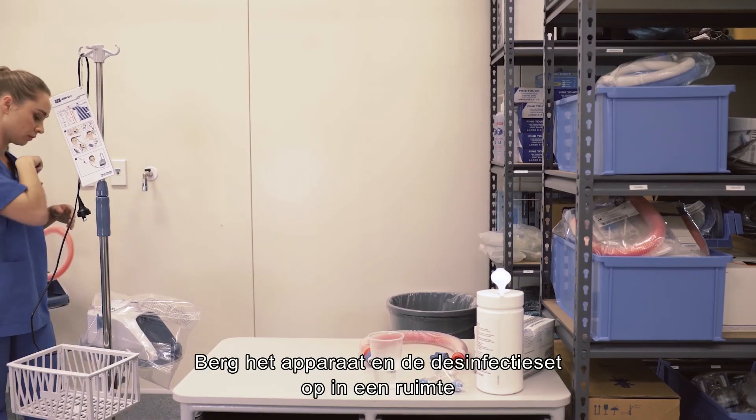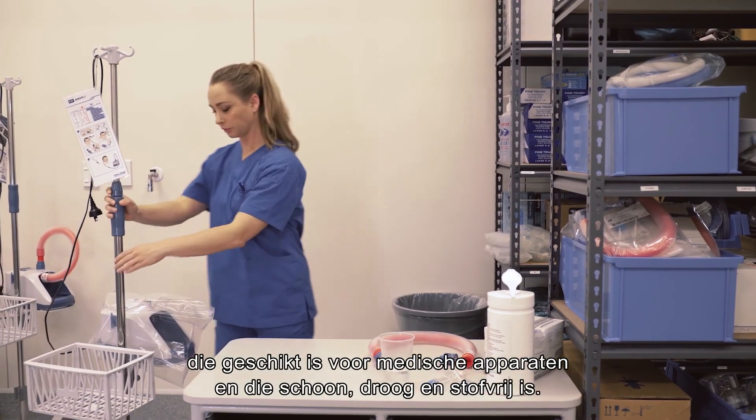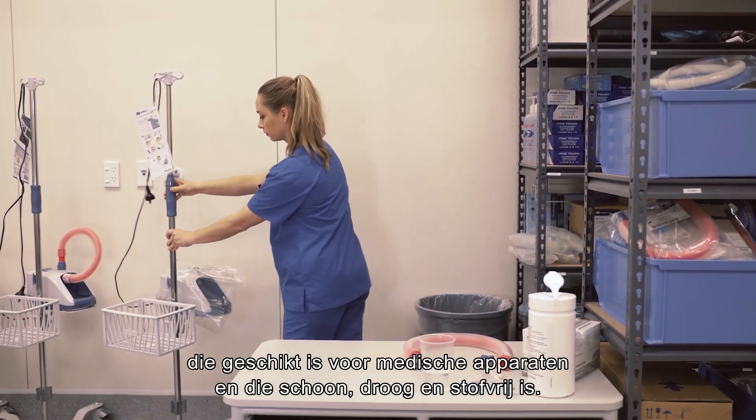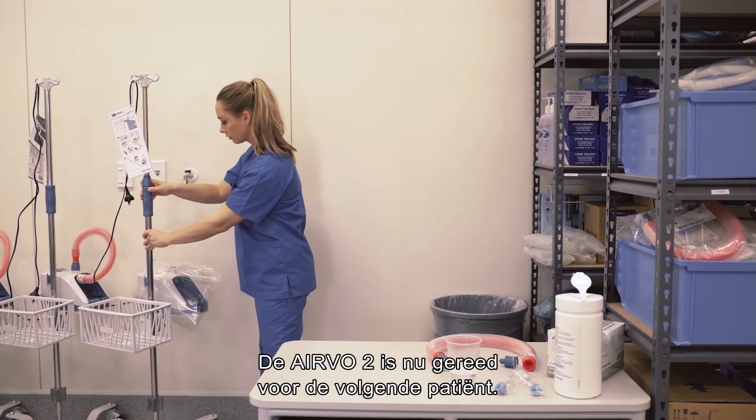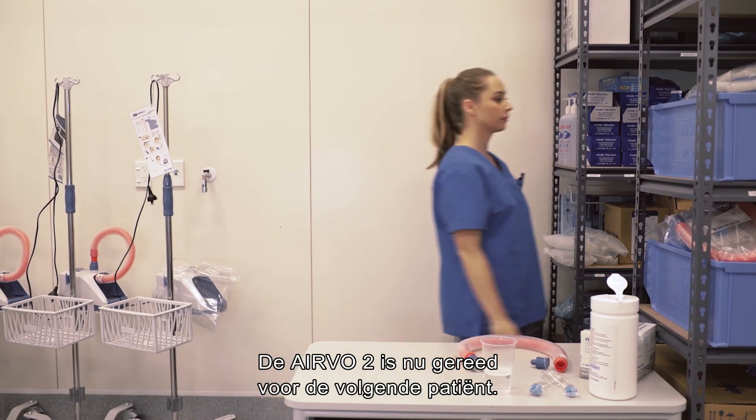Store the unit and disinfection kit in an area suitable for medical devices which is clean, dry and dust free. Never store the unit until it has been cleaned and disinfected. The AIRVO 2 is now ready for the next patient.